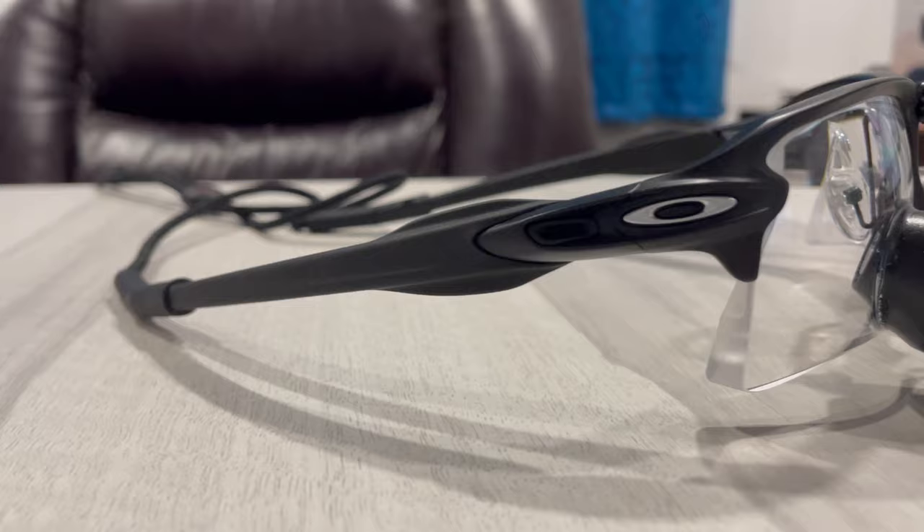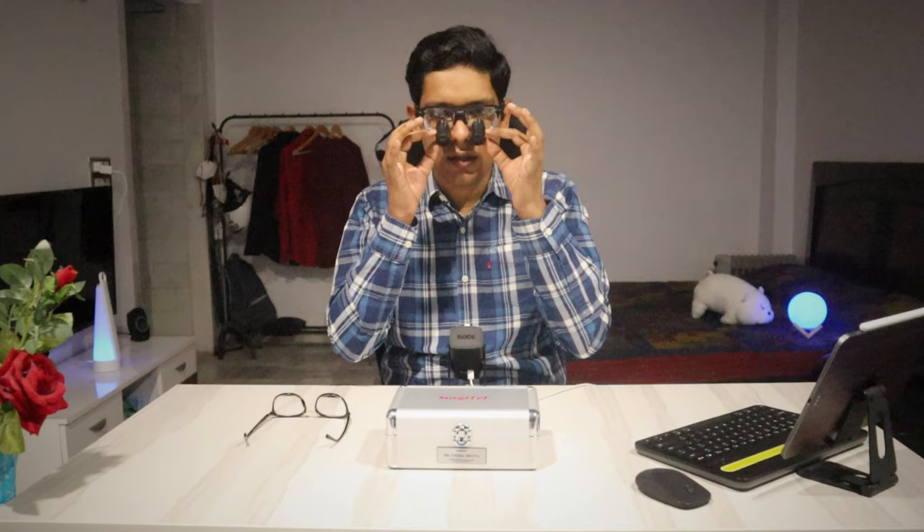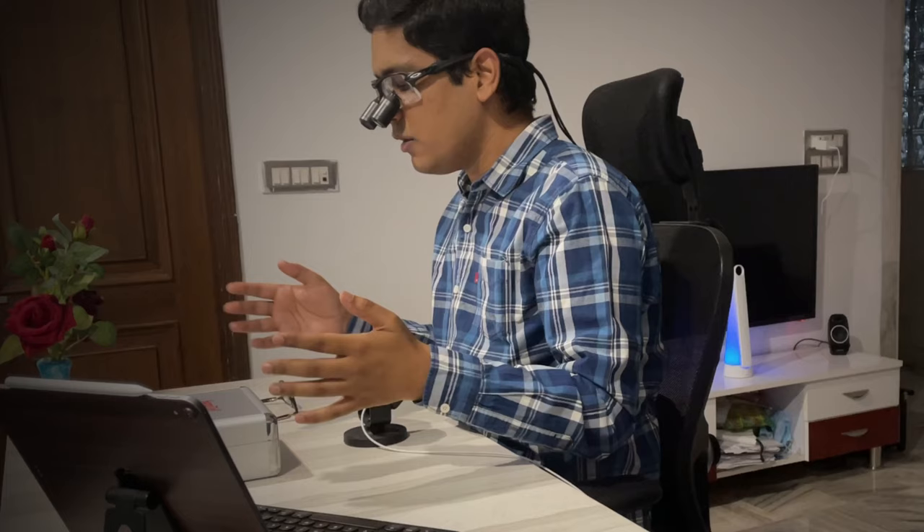So let's talk about the design. The spectacle frame is from Oakley. I chose Oakley because they are lightweight and they look good. This is the FLAK 2.0 model. The advantage of having a through-the-lens type of loop is that the loop itself is closer to your eyes — it is not in front of the lens, it is built into the lens. So it is very close to your eyes.